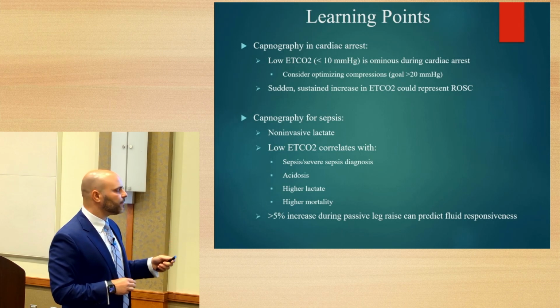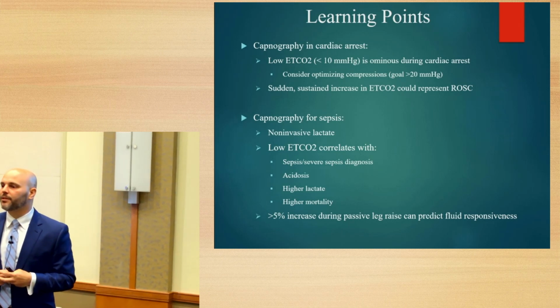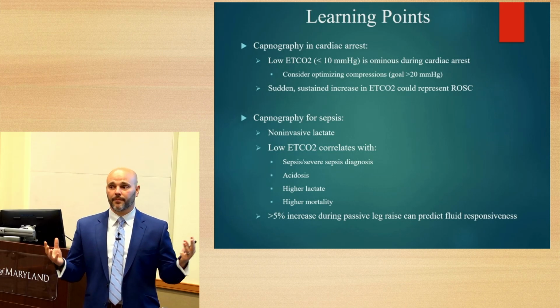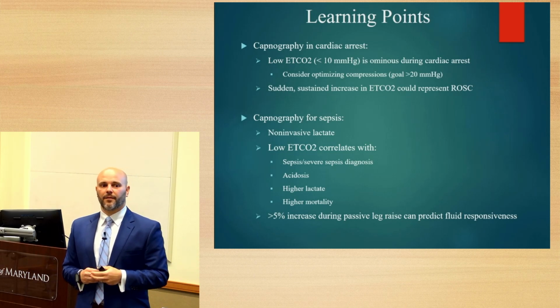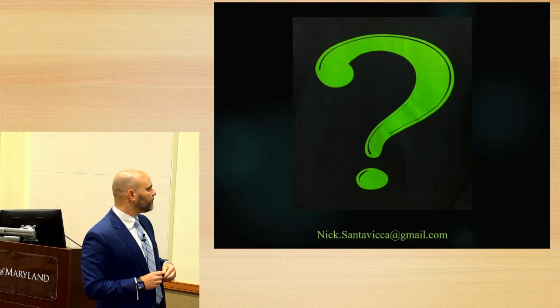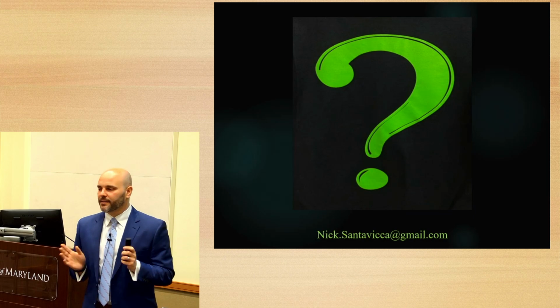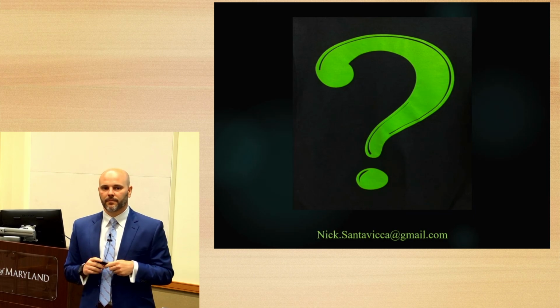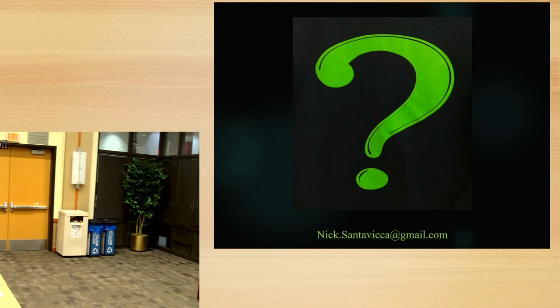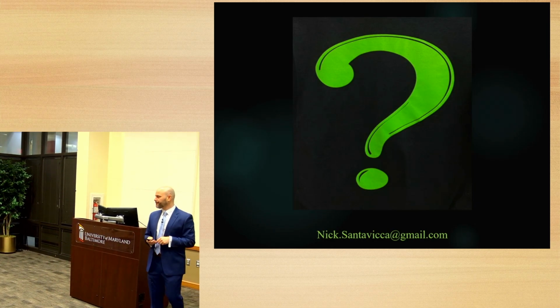And for sepsis, consider it as another use, like a non-invasive lactate. And if you can, see if it goes up with the fluid challenge. So next time you have a patient in the ED, try not to waste their breath, and think of using end tidal CO2. That's it.